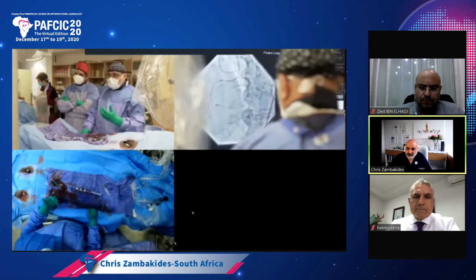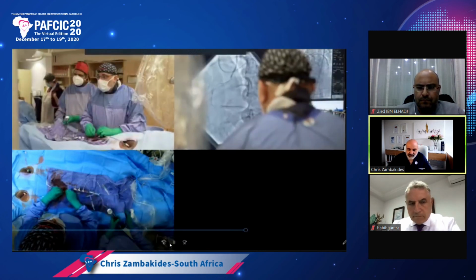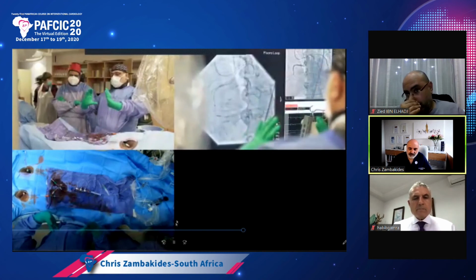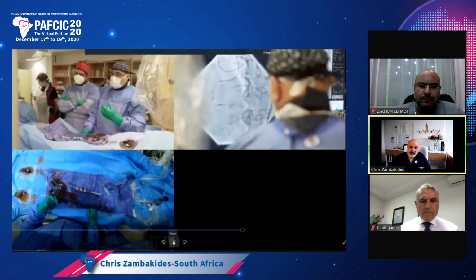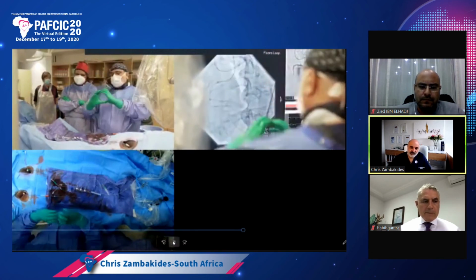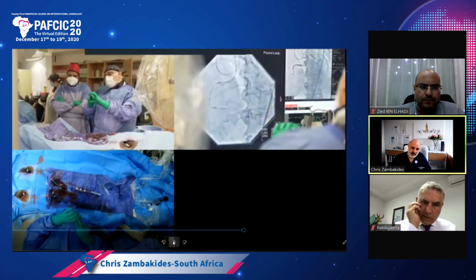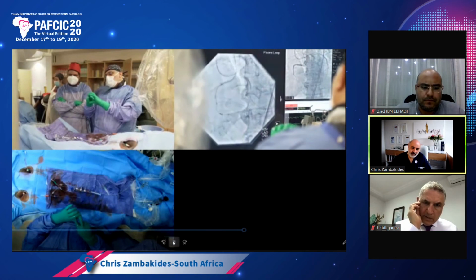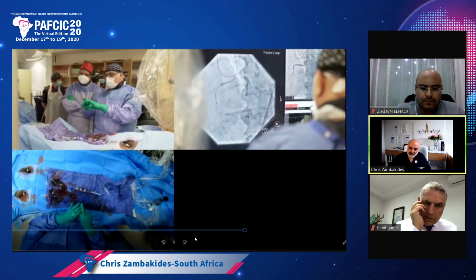You need to try and do the reverse CART. Yeah, this is important. I think this was in the middle, in your subintimal space. Marker balloons. Essentially, you need to try and do the reverse CART, so if you've got your lumen in the middle and your subintimal space, they either got to be in the true lumen, but in plaque, or they're both got to be subintimally. If the one's inside the lumen and the one's subintimal, it's very unlikely that you're going to join them.